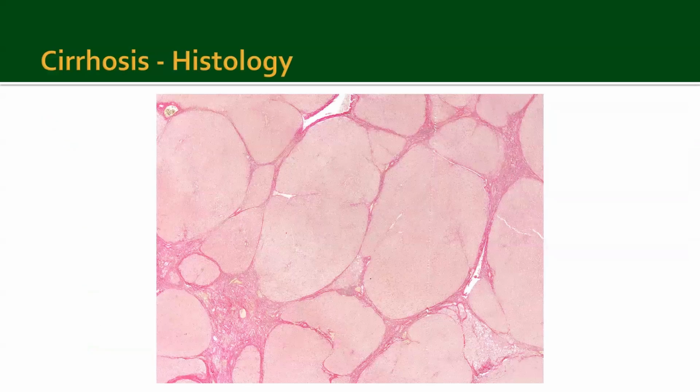And then for the histology, which is where this diagnosis I think is a little bit easier and a little bit more helpful, you can see that the normal lobules that you would expect to see on H&E for a benign liver are gone. It's just all been replaced by scar tissue. Obviously, if there's mostly scar tissue and no hepatocytes, that means this liver is not functioning very well, leading to the loss of function and all the other problems that come with having a non-functioning liver.